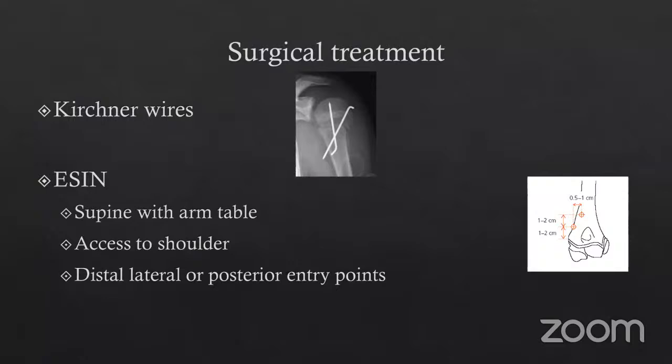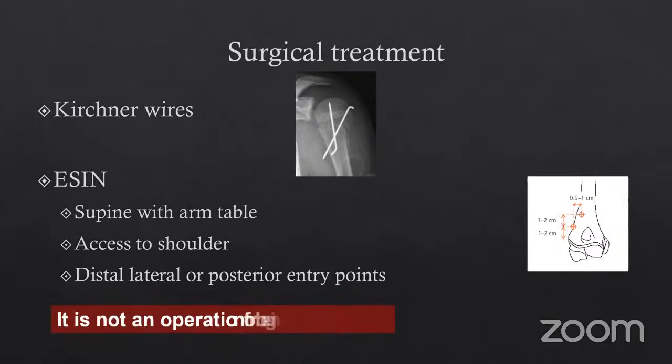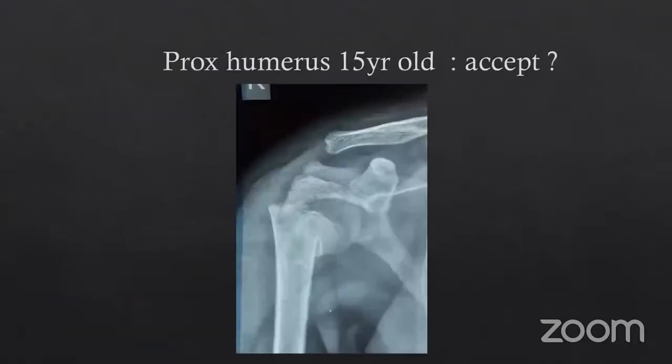And lastly, there is no skin irritation problem because it's not going from the skin. It is buried in the supracondylar region, right? So it is not an operation for beginners. You must be a little well-versed with how to do it.